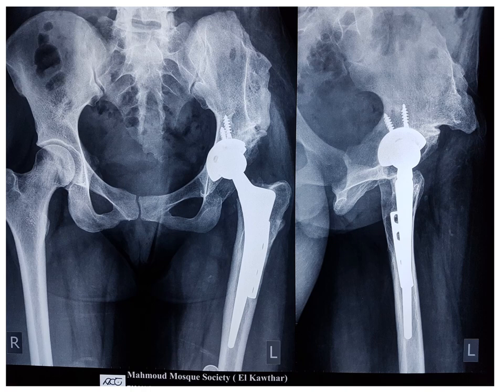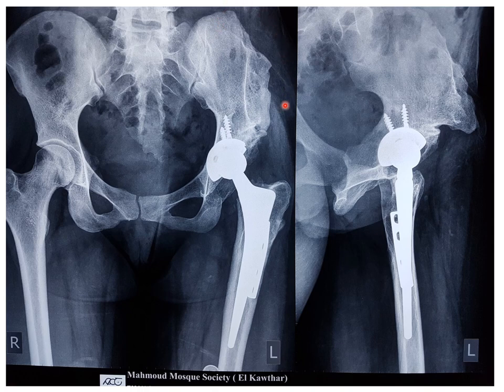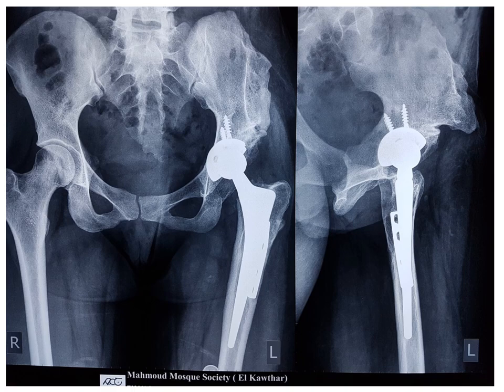Back to the post-operative x-ray — this is a clearer view. I'd like to send a message to pediatric surgeons: while doing this operation, you should be very careful when taking the graft for the Salter operation, because this is the situation when those patients become mature and older. Comparing the operation side to the normal side, quite a large piece of the pelvis was taken, and obviously the physis was damaged.